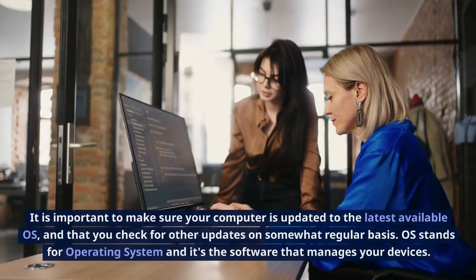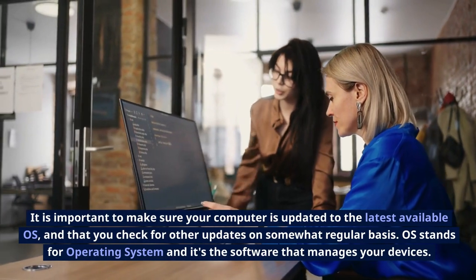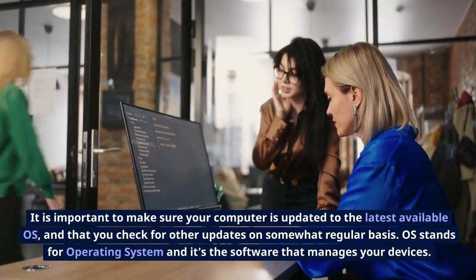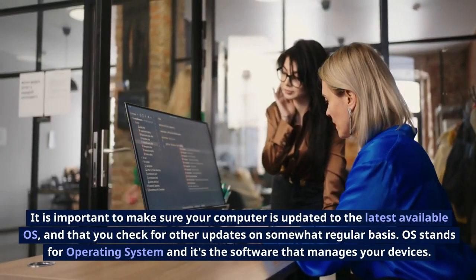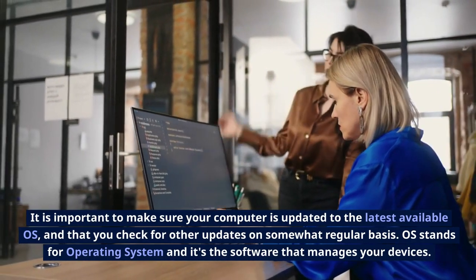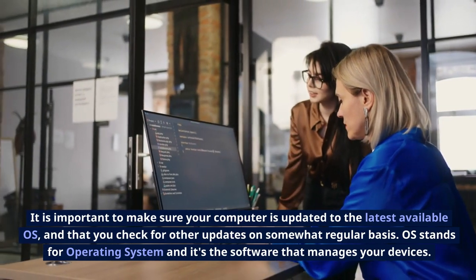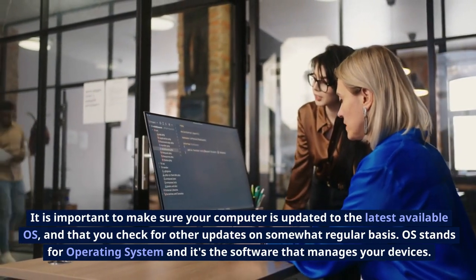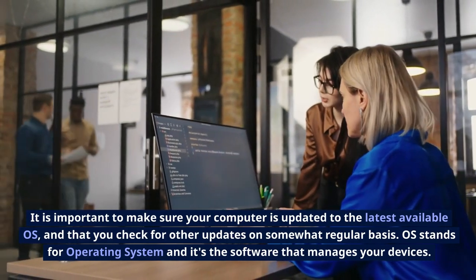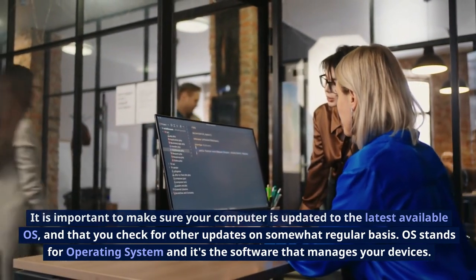It is important to make sure your computer is updated to the latest available OS and that you check for other updates on a somewhat regular basis. OS stands for Operating System, and it's the software that manages your devices.